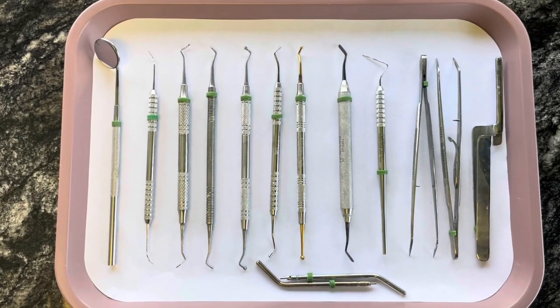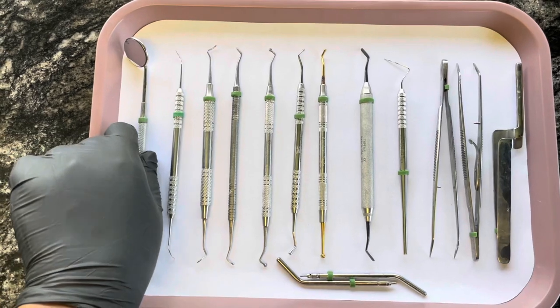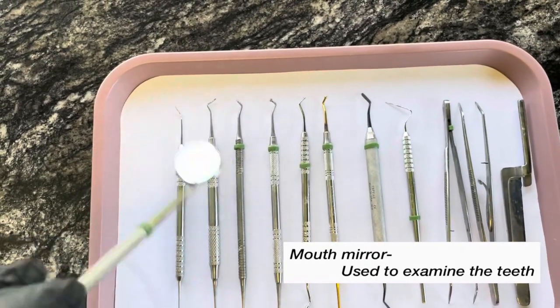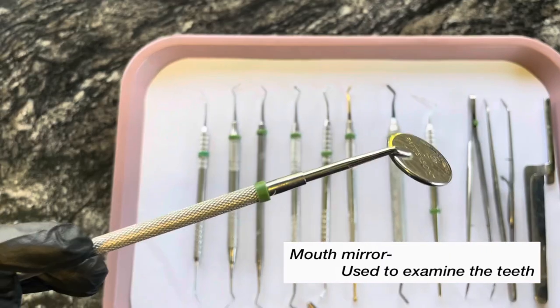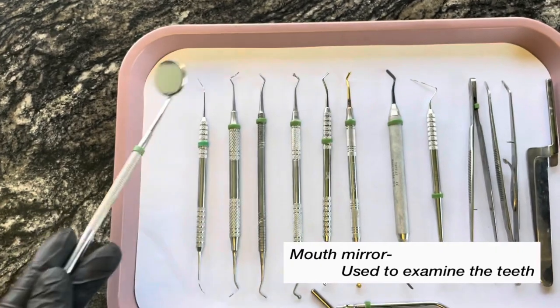So here are all of the instruments laid out. This is a mirror, and this is just used to look in the patient's mouth, to look around at the teeth. You can also retract with this. It's just the mirror — self-explanatory.